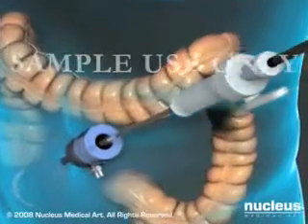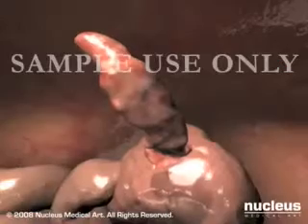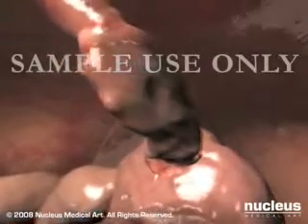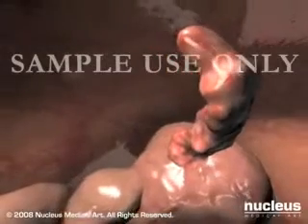Next, your surgeon will insert the laparoscope through the umbilical port. Images from its camera are projected onto a video monitor in the operating room. Your surgeon will carefully examine the inside of your abdomen, confirming that your appendix is red, swollen, and needs removal.